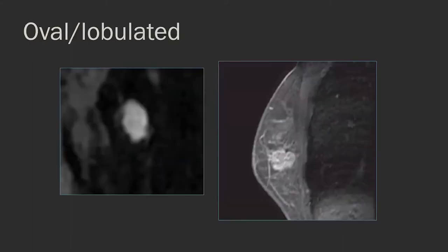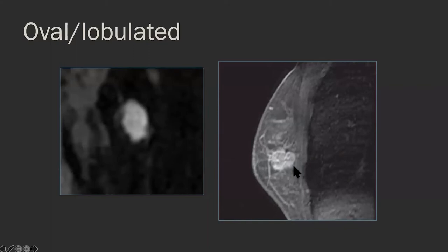Round is straightforward — here's a round mass which was a lymph node. This is an oval and mildly lobulated mass. How lobulated can something be before it becomes irregular? If you have two to three, maybe four gentle lobulations, I'd still call it lobulated. Once it starts getting more than that, move it into irregular. Here are two examples of irregular shaped masses — we're talking about the shape, not the edges.